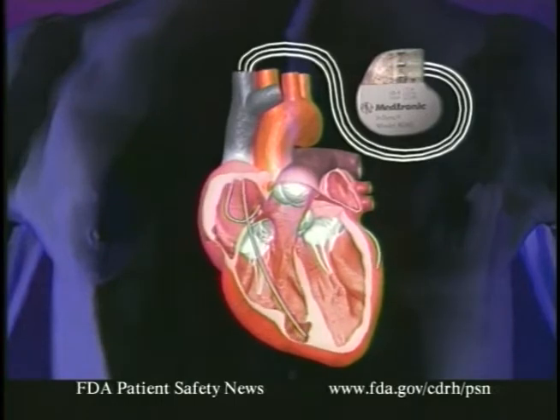Even though this device may relieve some of the symptoms of congestive heart failure, it's not been shown to be useful in all heart failure patients. It should be used only in patients with moderate to severe symptoms of congestive heart failure whose ventricles are not contracting simultaneously and aren't likely to improve with additional drug therapy. And it shouldn't be used in patients whose congestive heart failure is reversible.